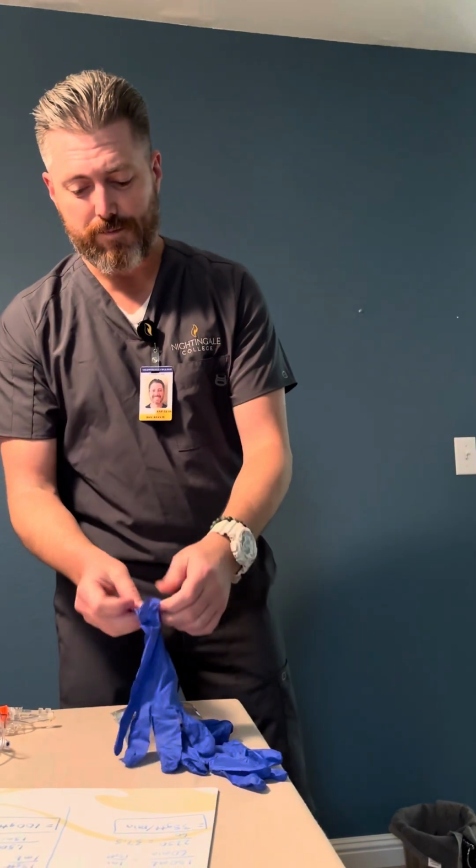Hi, my name is Ryan, student at Nightingale College, today performing the task of IV fluid and medication administration. First thing I do is I would do hand hygiene and put gloves on.